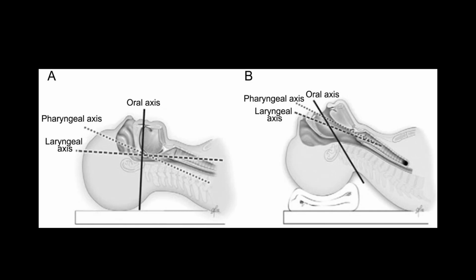In terms of direct laryngoscopy, the entire premise is to use a tool that allows you to create a visual access that lets you look around the oropharyngeal corner to insert an endotracheal tube through the glottis. You can see there are three different axes we typically think of: an oral axis, a pharyngeal axis, and a laryngeal axis. Ideally, we're creating an environment with direct laryngoscopy that allows us to align these axes with one another. We often can't do this perfectly, but we try to get the oral, pharyngeal, and laryngeal axes as parallel as possible, and direct laryngoscopy provides us with a means to do so.